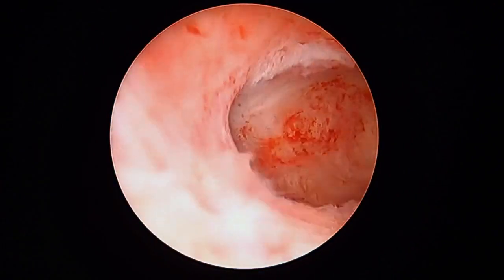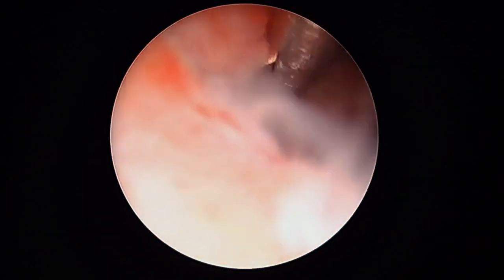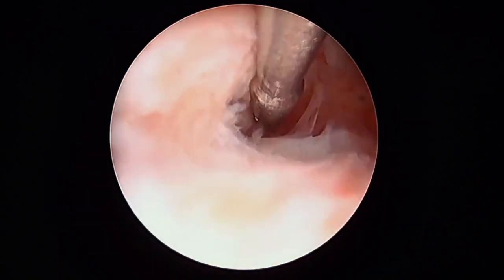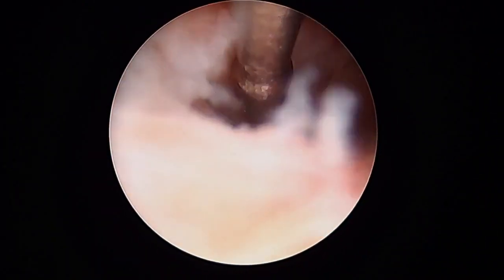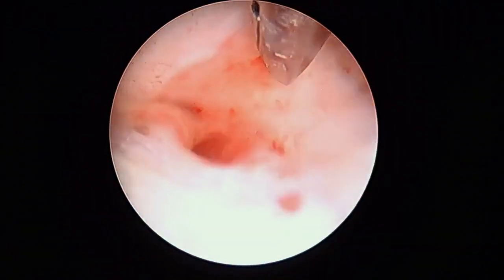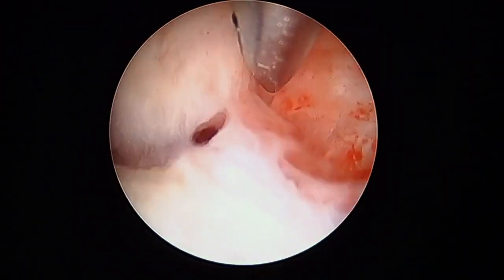Upon entry into the endometrial cavity, scar tissue was initially noted on the right cornual region. With hysteroscopic scissors, scar tissue is taken down slowly and gradually towards the corneum.